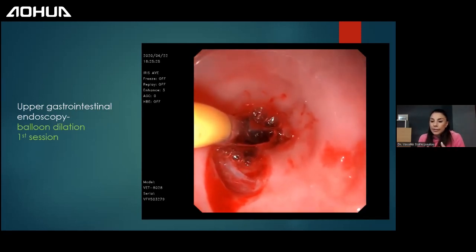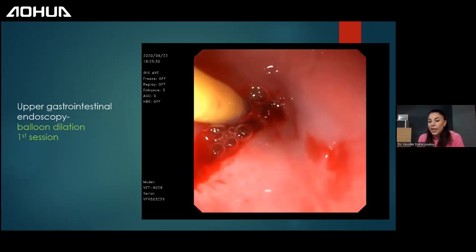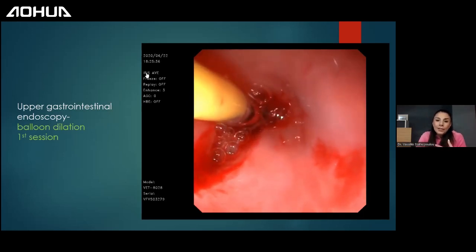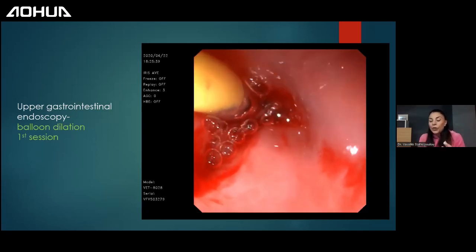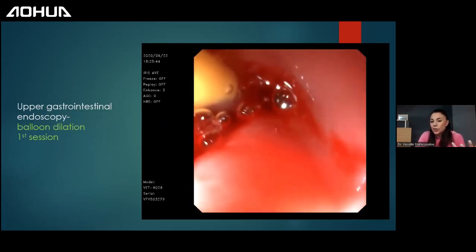You have to understand that in this procedure, you will have to cause trauma, major trauma. So don't be afraid to cause it. Otherwise, your procedure will not be successful. So if I had to say one pitfall, one common mistake that people make in these procedures is that they're scared, so they do not dilate the balloon, or they choose a balloon diameter that's smaller than it should be, so they do not cause big trauma to the esophagus. And we have restricturing, very easy restricturing after that.